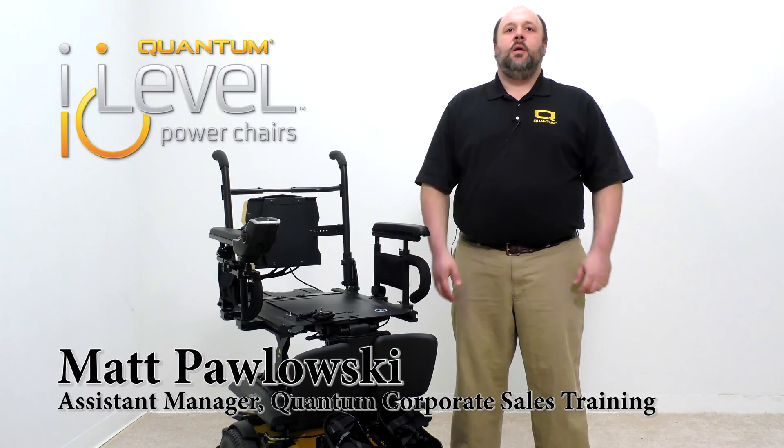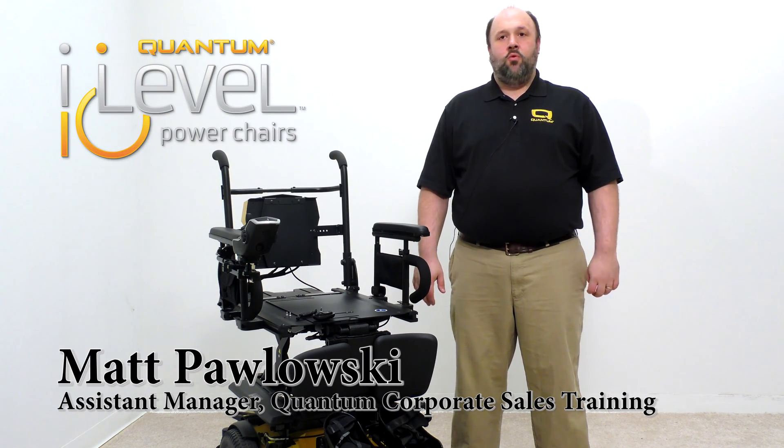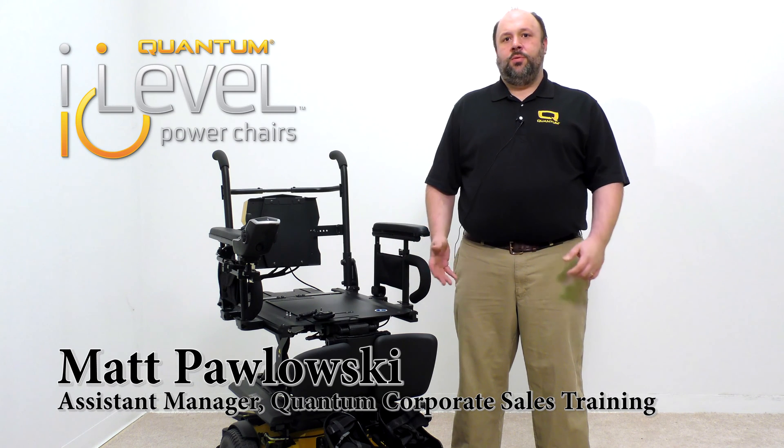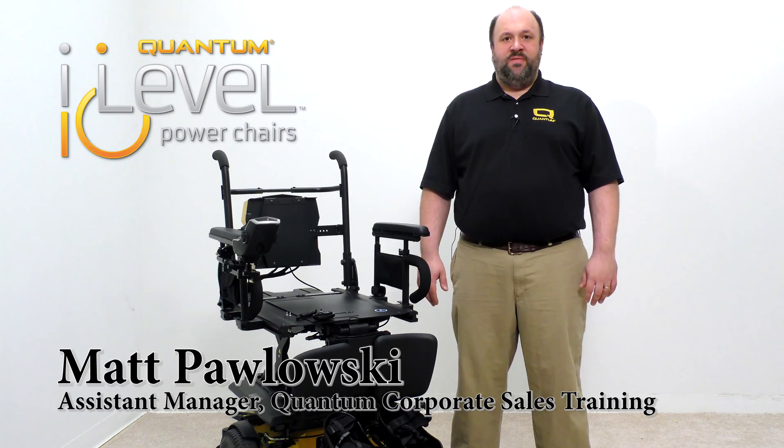Good morning, my name is Matt Pulaski. I'm the assistant manager of Quantum Corporate Sales Training here at Pride Mobility Products, and today we're going to show you the retrofitting of our switch-operated fender lights.